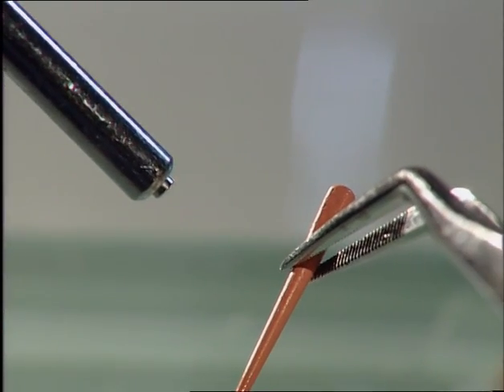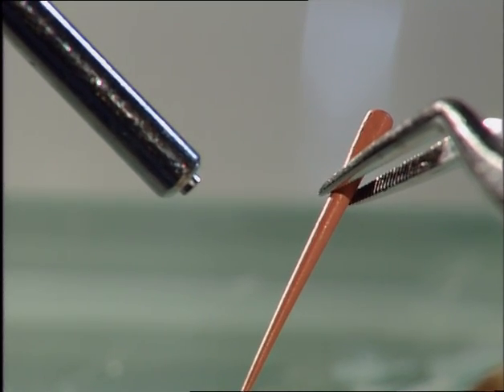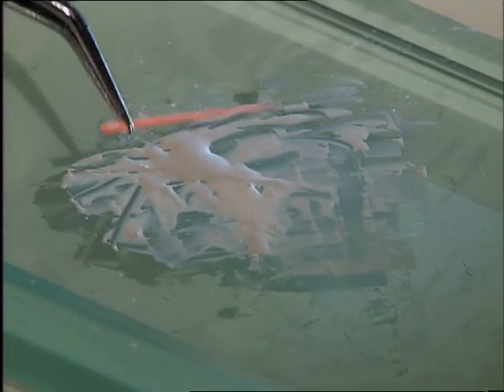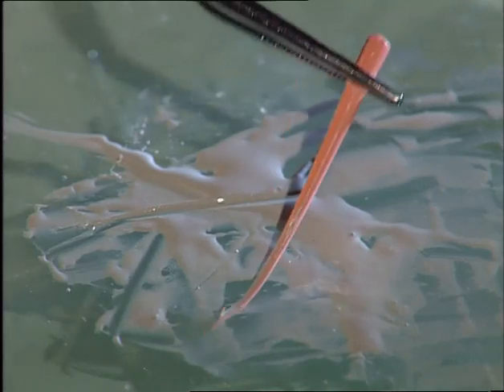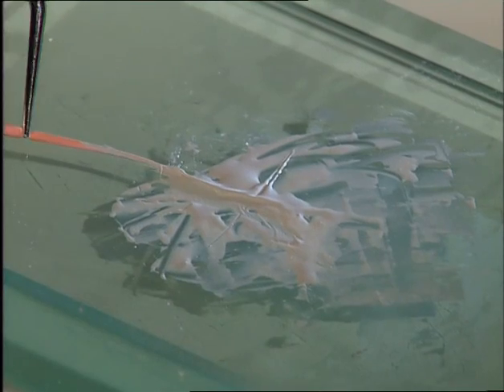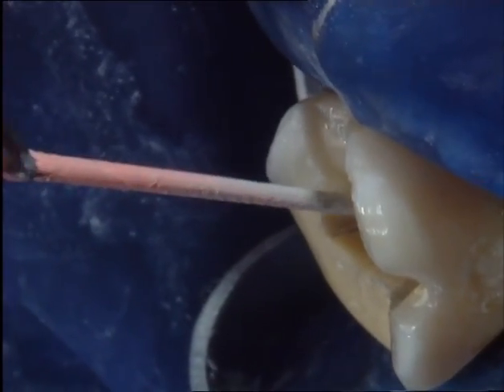The master cones are sterilized in sodium hypochlorite, rinsed in alcohol, and dried with the air-only syringe. Remnants of sodium hypochlorite get eliminated and the cones get stiffer. The pre-fitted master cone is slightly buttered with sealer. The sealer should be mixed somewhat thicker than the manufacturer's recommendation. Before the cone is inserted in its final position without pressure, the carefully rinsed and dried canals are covered with a very thin layer of sealer.